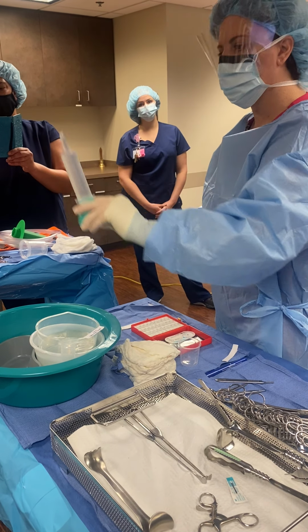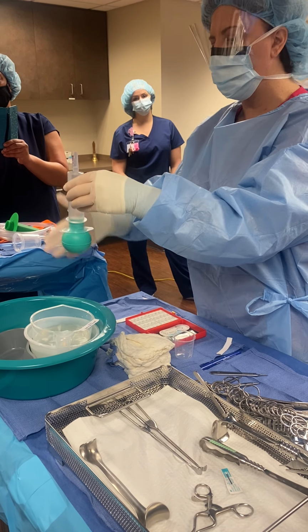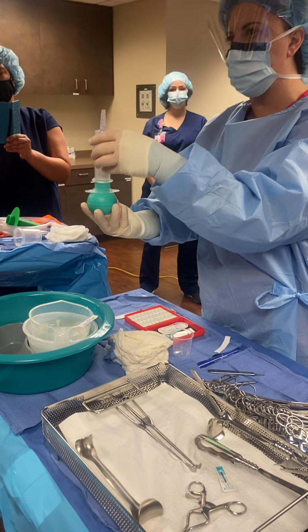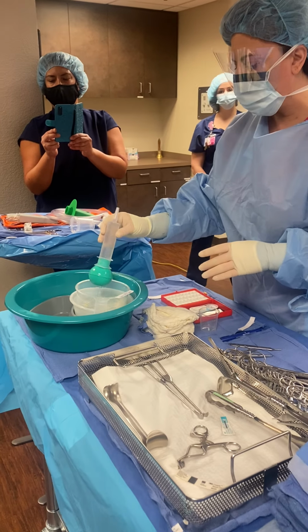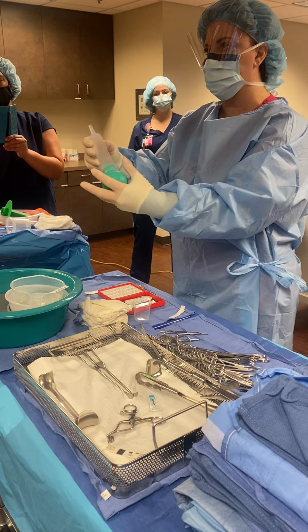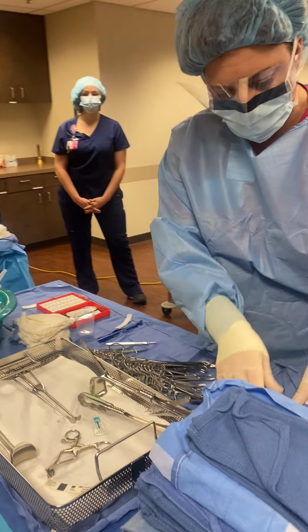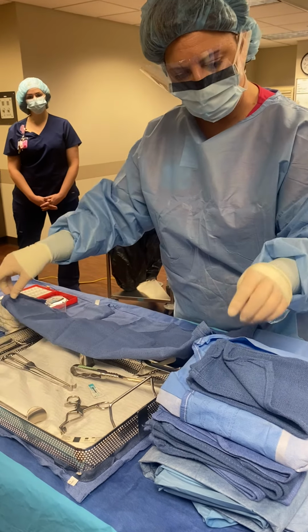You don't want to pass it to your surgeon half full, right? And then this also helps you to know how much, like this is 120 mLs, 60 from here to here, and then 60 in the bulb. And then I place it in here like this because I know when it's time for me to give it to my surgeon, it's easy for me to grab it and put it in their hand like this. That's how they're going to want to use it. Okay. And then I think just my drape towels, I should be ready.